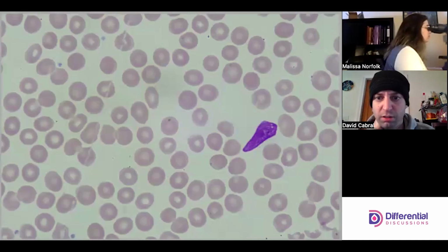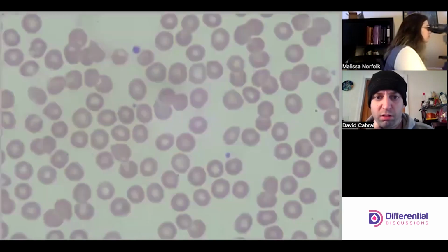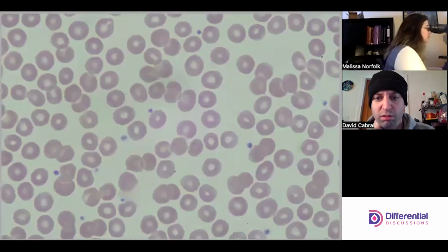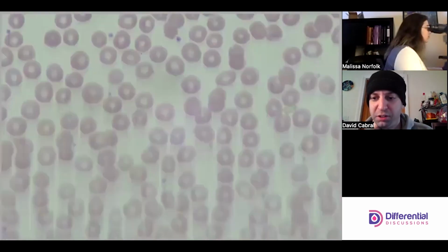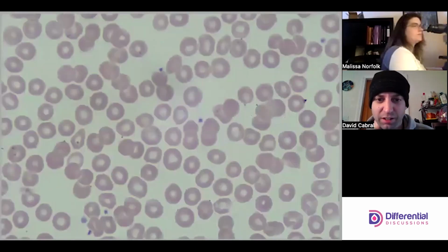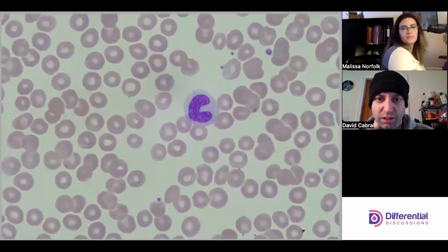A smudge. EO. So there's my 3% EOs. Nice mono. Wow.